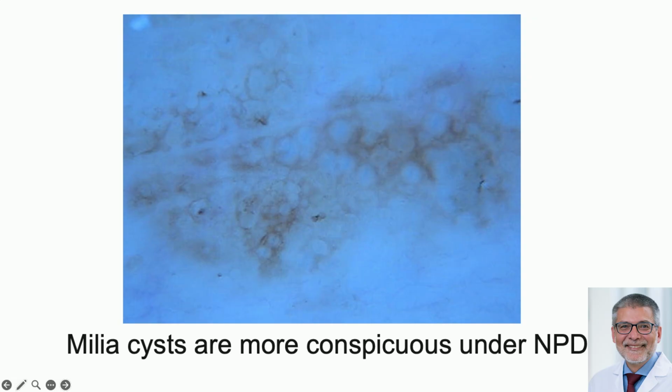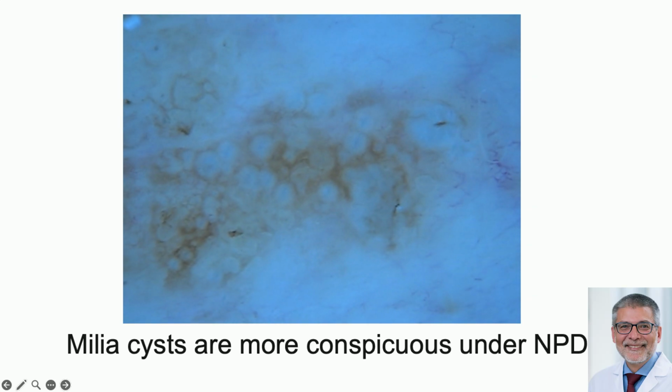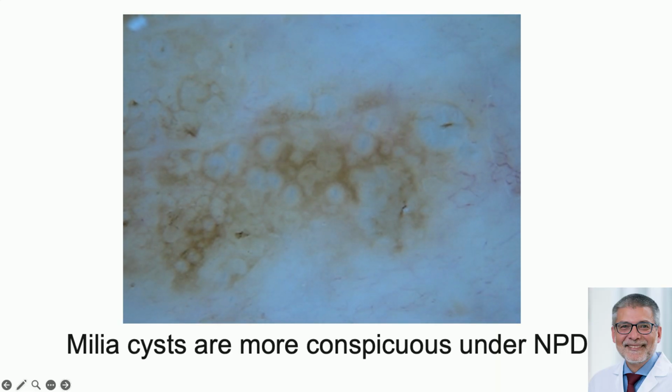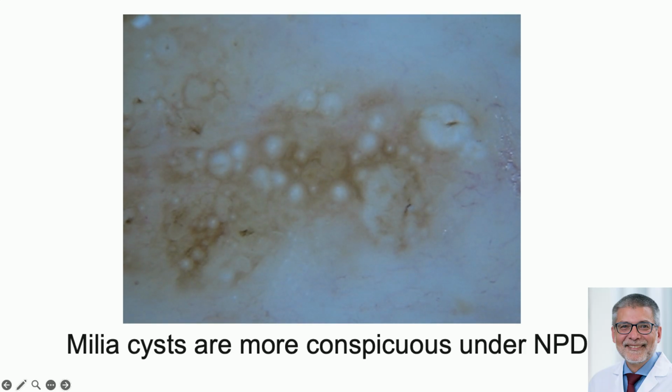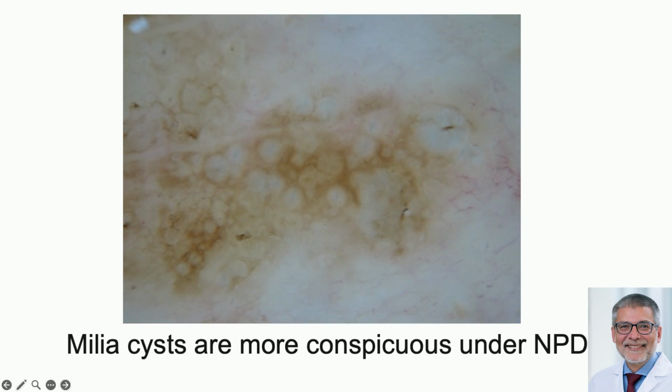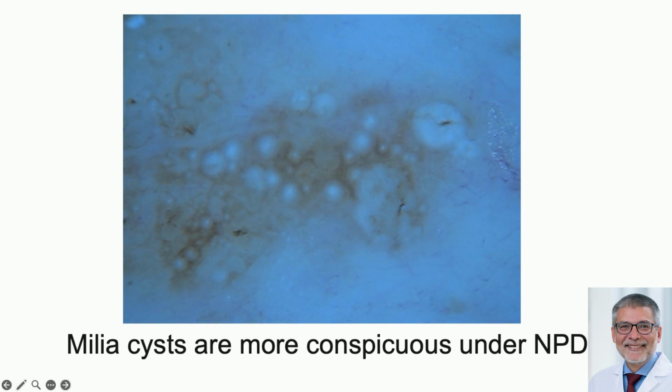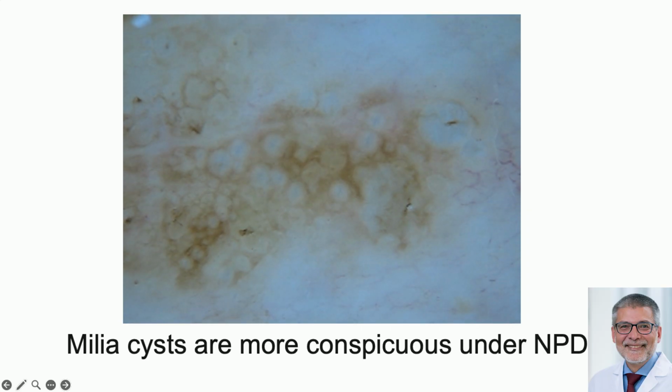And I think the AV tech may need to just hit that slide. And then it'll toggle between polarized and non-polarized. Can you just hit the slide? And yep, okay. There, the milia. So non-polarized, polarized. You're just basically toggling the light source from the polarized to non-polarized mode, right? And so if you only use polarized dermoscopy, you will probably over-biopsy seborrheic keratosis, okay?